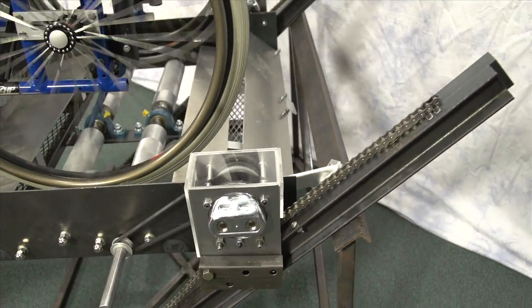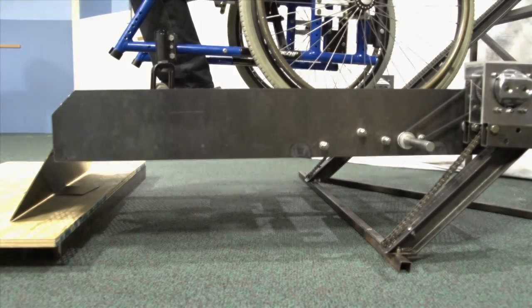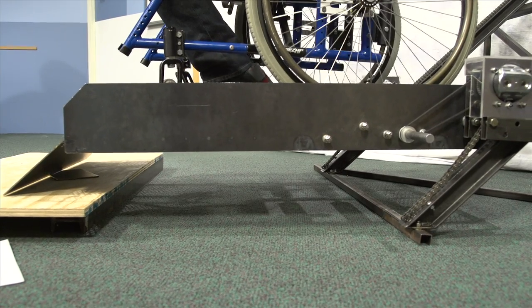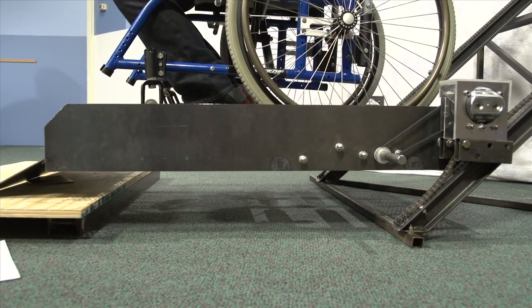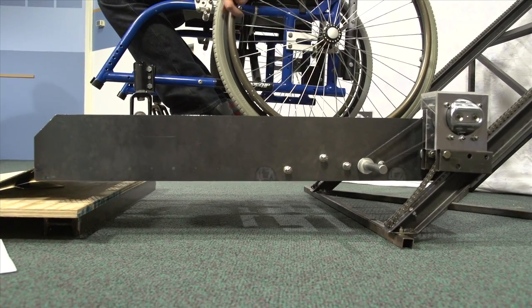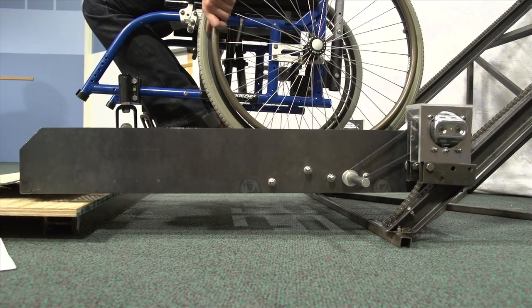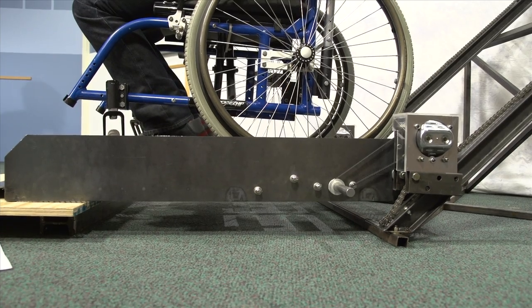Once they reach the top, we can see the top safety gate rotating down to serve as an exit ramp. A user can go down the funicular in the same fashion. When they rotate their wheels the opposite way, the funicular descends down the rails and the top gate returns back to its safety position. Again, the user can stop for any reason and the platform remains in place. Once the funicular is at the bottom, the gravity operated gate rotates down and the user exits the funicular.